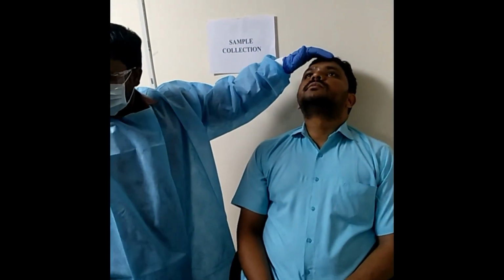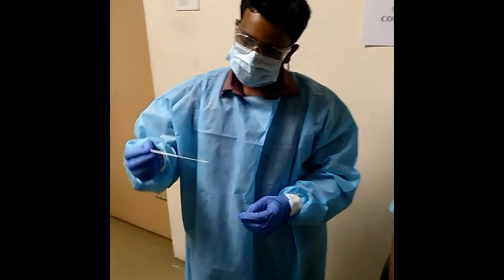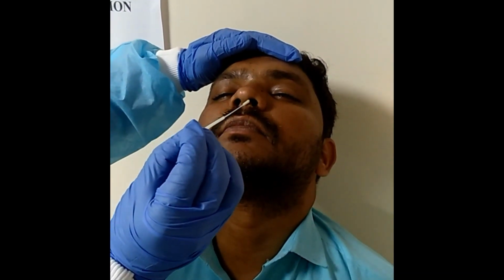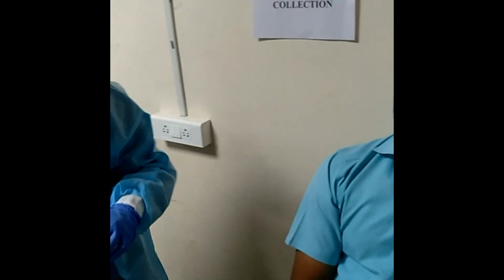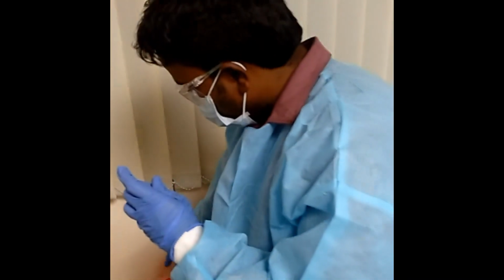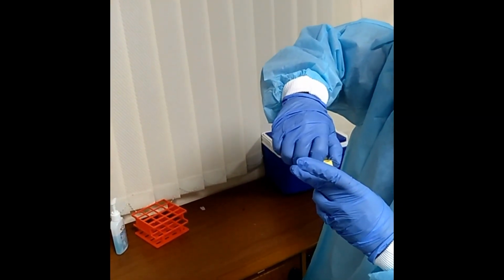For nasal swab, remove a fresh swab and insert it into the nostril 1 to 2 cm parallel to the palate. Leave the swab in place for a few seconds and then withdraw it slowly in a firmly rotating motion. Swabbing should then be done for the second nostril with the same swab. Place the swab immediately into the VTM already containing the throat swab and break off the applicator stick as done earlier. The VTM vial is then placed in the cool box.